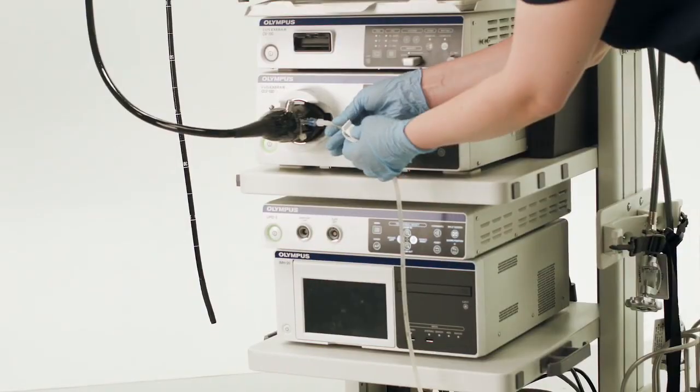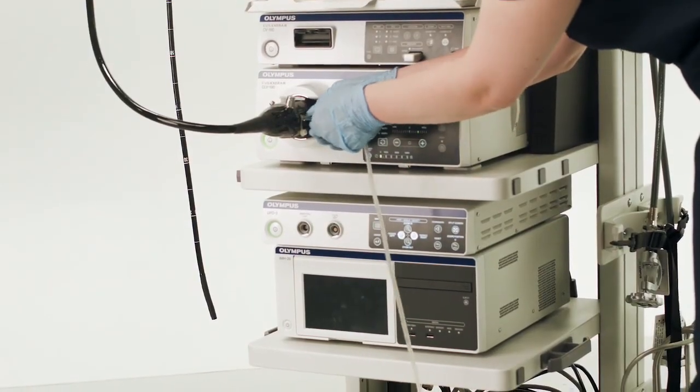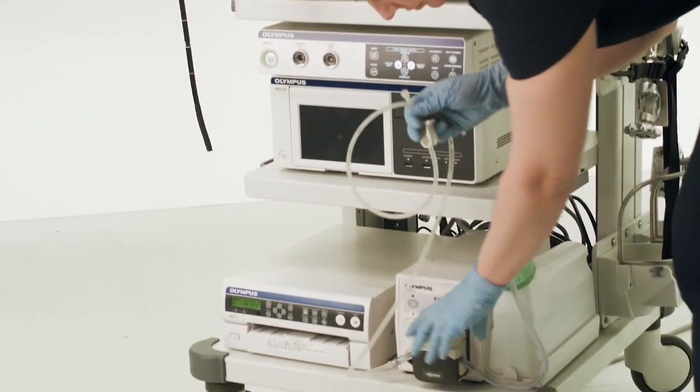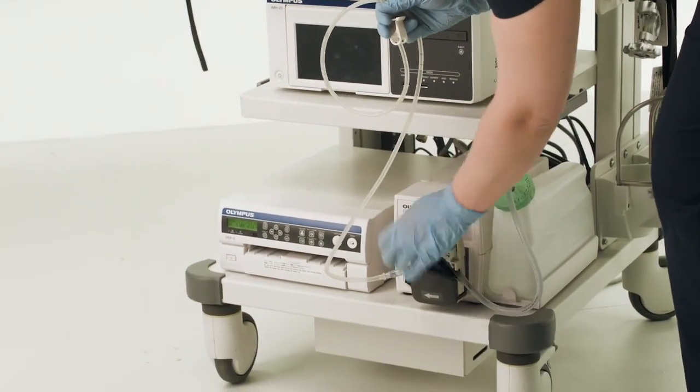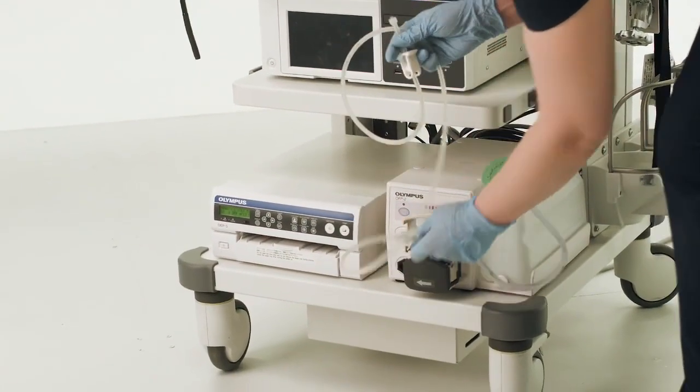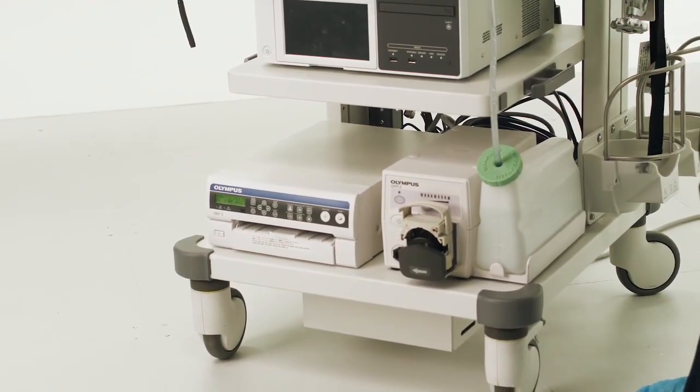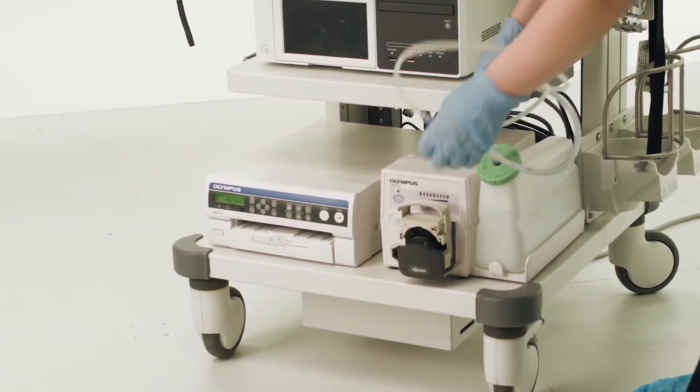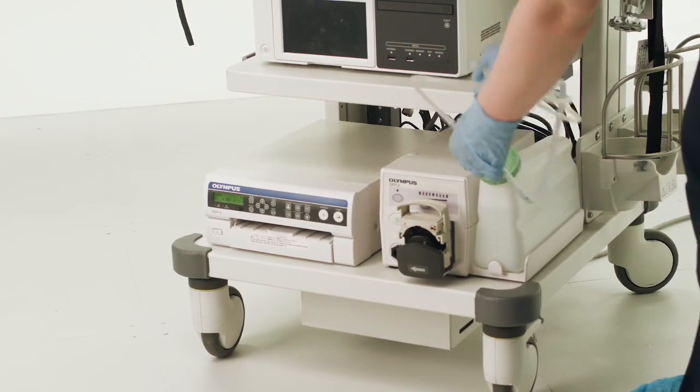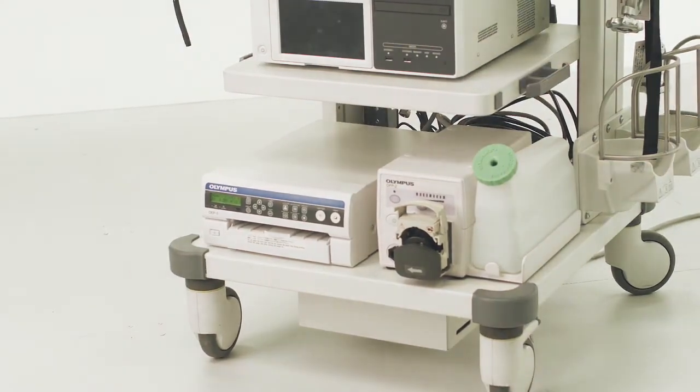After final use, engage the pinch clamp. Holding the water tube higher than the water container, lift the pump head and then release the pinch clamp to allow the water in the tube to return to the water container. Dispose of the MAJ 1651 and MAJ 1652 in accordance with hospital guidelines.